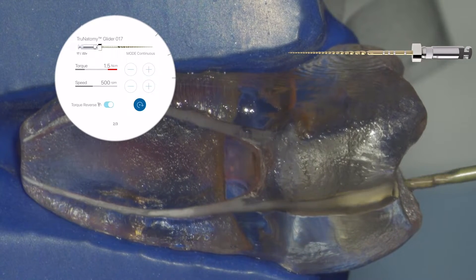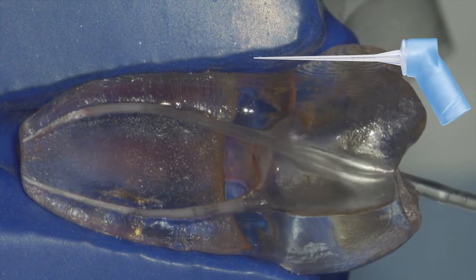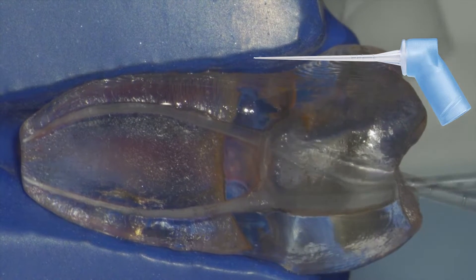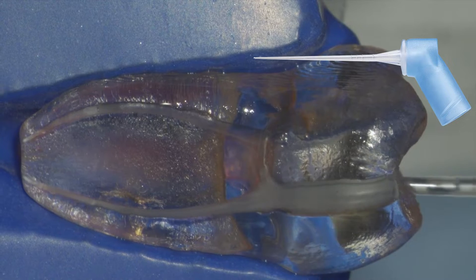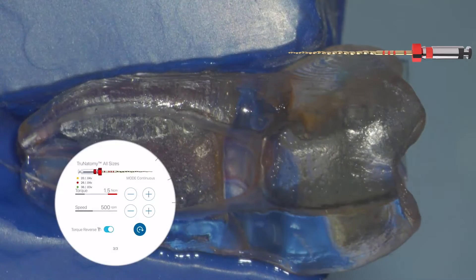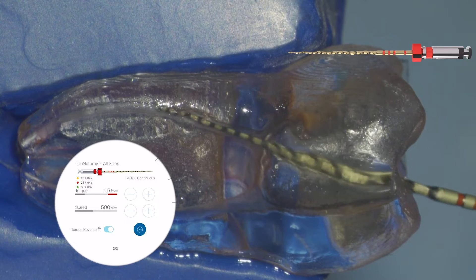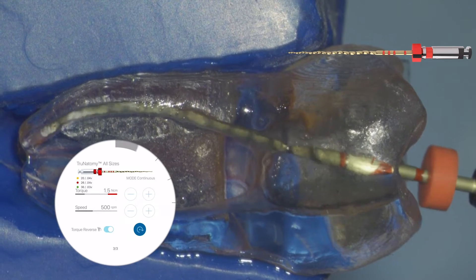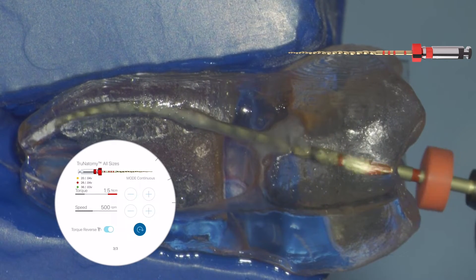Once you have your glide path, rinse the chamber and irrigate the canal, and you are now ready for shaping. You always want to start your shaping objective with the prime instrument — it has a red band and red stopper, with a tip size of 0.26. Run it at 500 RPMs with a torque of 1.5.